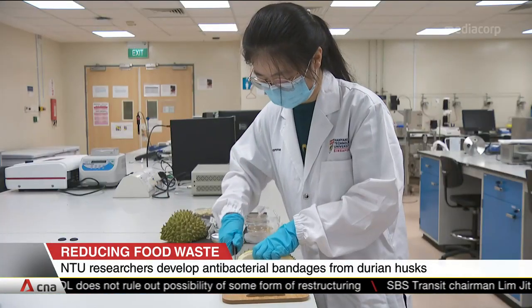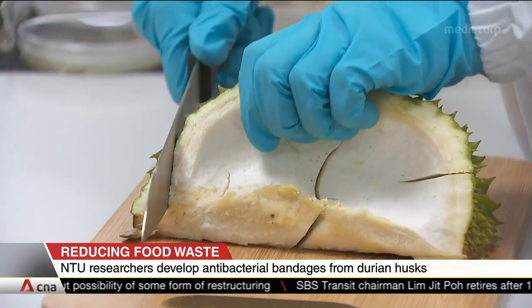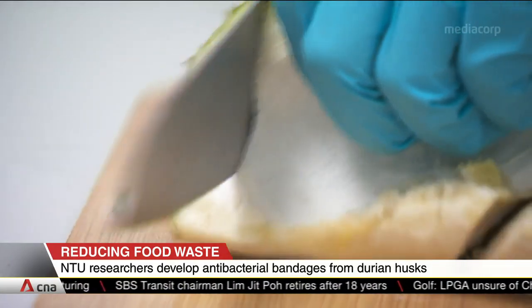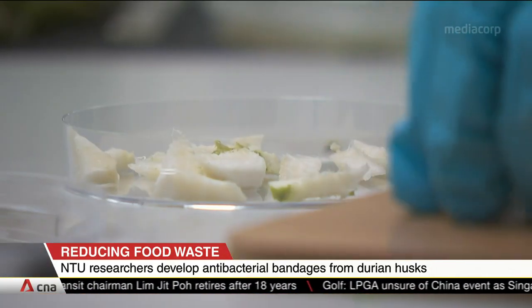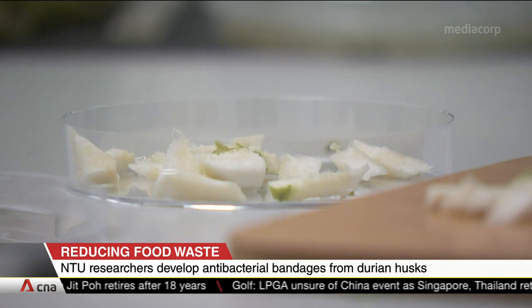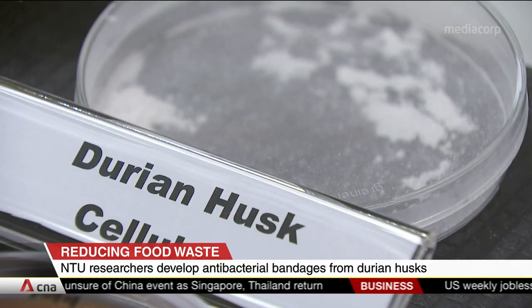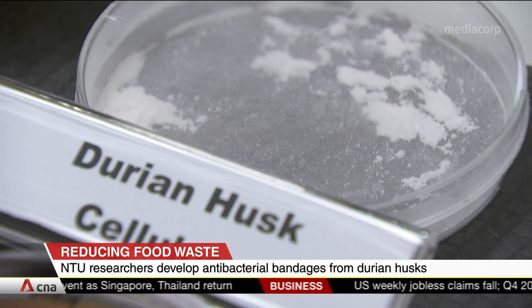The process involves extracting cellulose, a substance found in the cell walls of plants, from the husks. It's then combined with a type of sugar alcohol known as glycerol to form a soft gel sheet. Organic molecules from natural yeast are added to give the hydrogel sheet antibacterial properties.